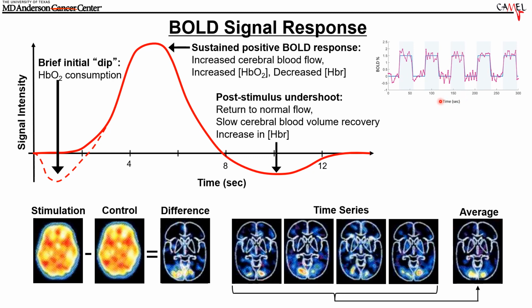You can do other physical activities too to cause the brain to be stimulated. Have the patient smell a certain scent or tap their finger on a table and so on. And so you can watch this time series. And because you know the series of stimuli that you gave to the patient, you can then map that onto the change in signal to clean up the data and get even better images than you did with just one time point over here to the left. You can see the right is much better.